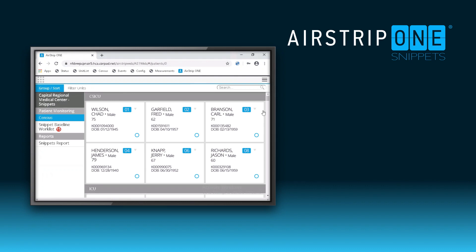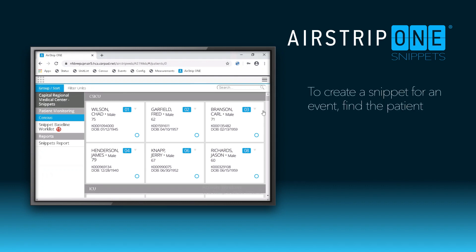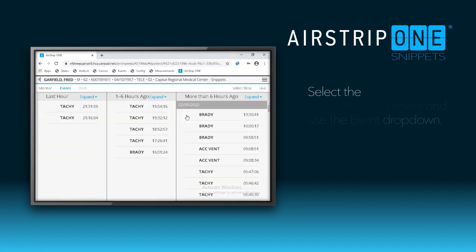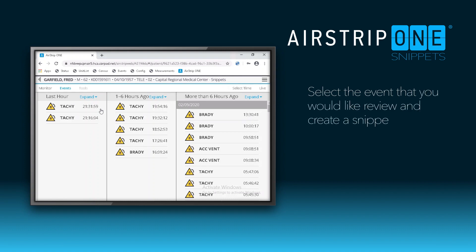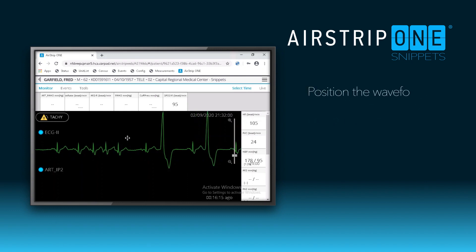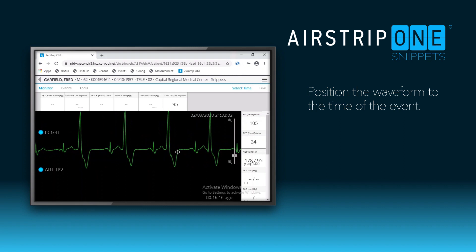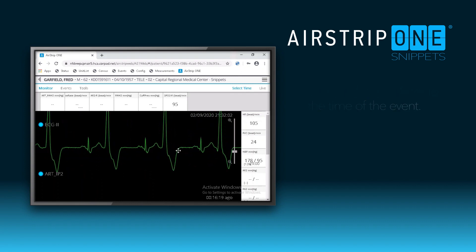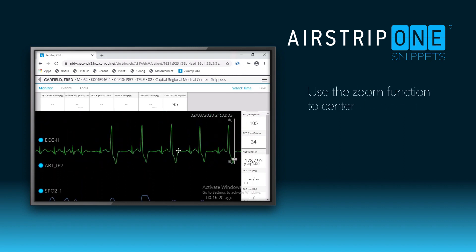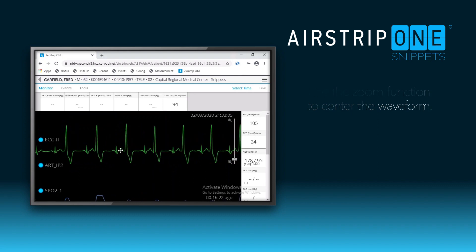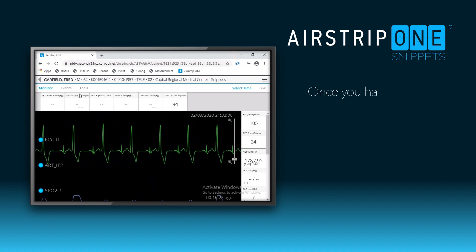If you are a monitor tech and wanted to create a snippet for an event, find the patient and use the quick link dropdown to go straight to the events list, and select the event that you want to document. Scroll to position the time of the event that you would like to document. Adjust the size using the sidebar zoom, and then select the tools option.